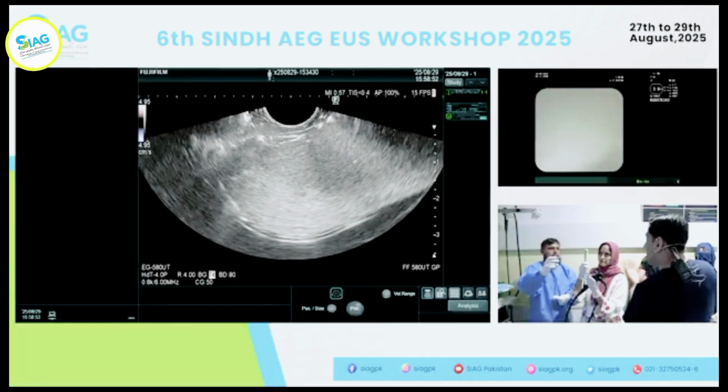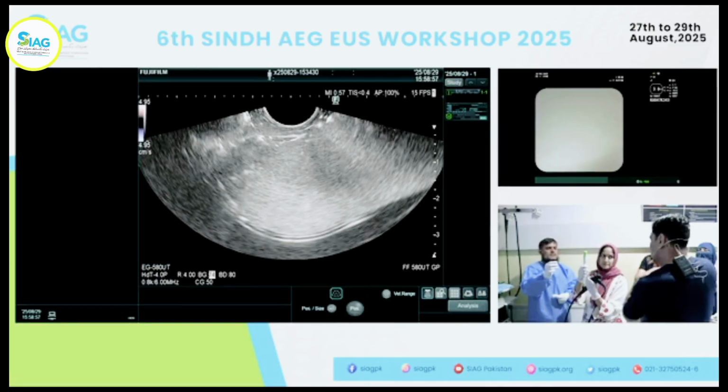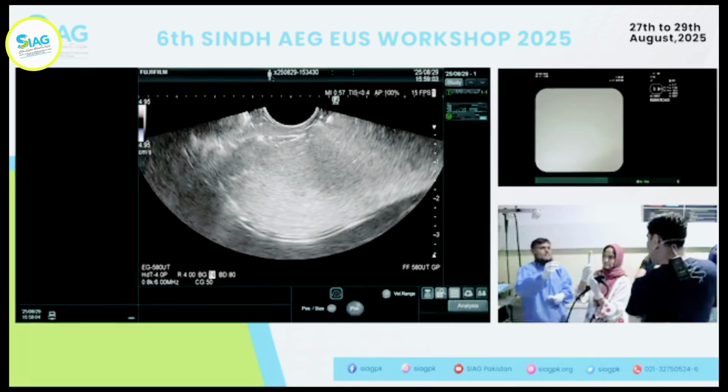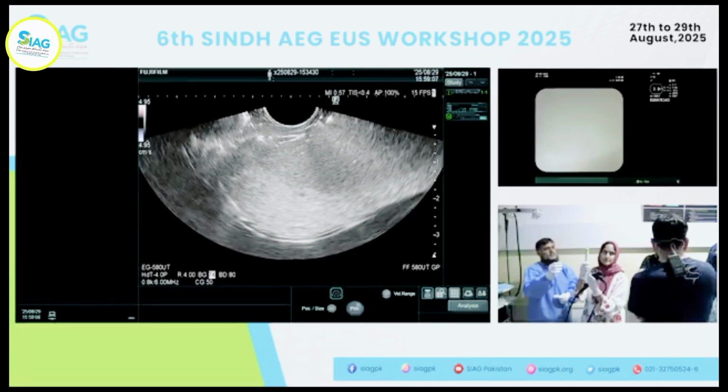For liver biopsies, you don't want to take it out all the way. I normally take up to a minute, and sometimes more than that. I normally have a heparinized needle, to reduce the risk of clotting, and I take it out very, very slowly, and with the Doppler on. I don't go in with the Doppler on, but I always take the needle out with the Doppler on.